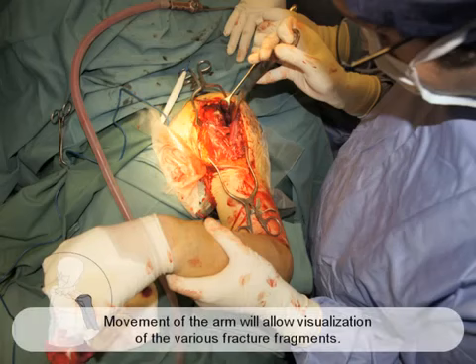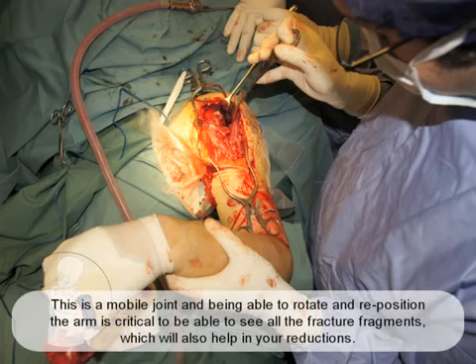Movement of the arm will allow visualization of the various fracture fragments. This is a mobile joint, and being able to rotate and reposition the arm is critical to be able to see all the fracture fragments, which will also help in your reductions.